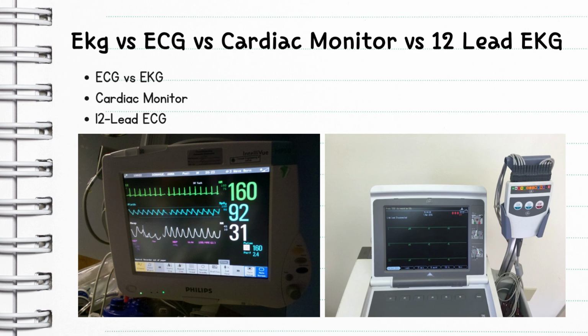Both terms are used interchangeably to describe the process of recording the electrical activity of the heart over a period of time, which is essential for diagnosing various heart conditions. In clinical practice, ECG is more commonly used, but EKG is still prevalent in some contexts, especially in historical or European settings. I will let you know, in the ER, I hear EKG more than I hear ECG.